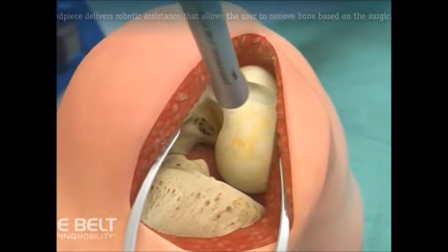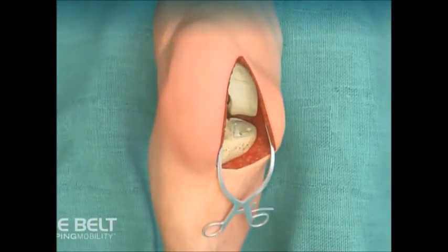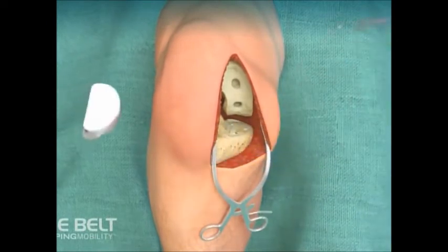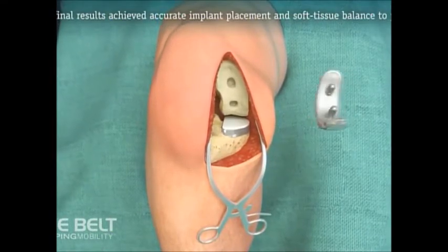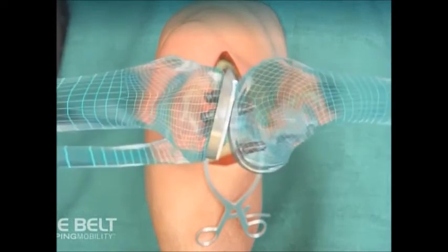Now, you mentioned a 3-inch incision. That's better than a big foot-long incision to put the whole knee in. So tell us what's the difference between doing a total knee and doing a robotic knee in recovery time. Well, obviously with a partial knee, you just have that one portion there that you can see being replaced, and it causes a lot less pain. There's a lot less cutting that has to be done, so there's less bleeding. Rehab's a lot easier, and you can actually have this done and go home the same day.